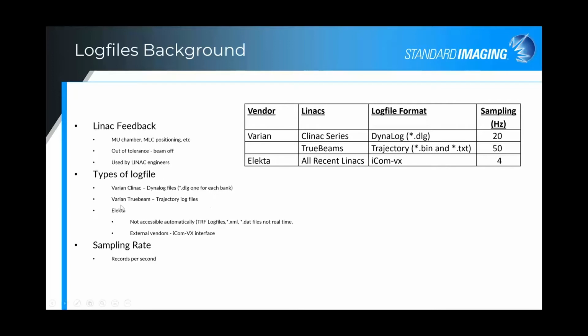There are different types of log files dependent on your Linac type, and these log files are gathered at different sampling rates, dependent on your Linac type as well.